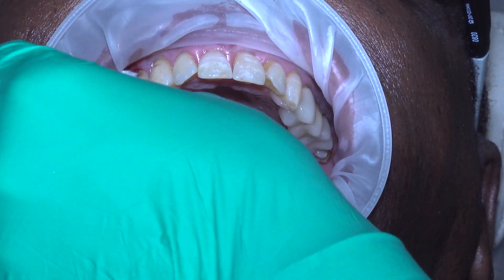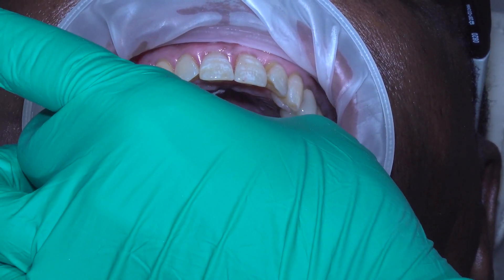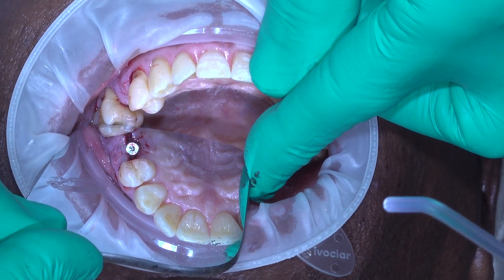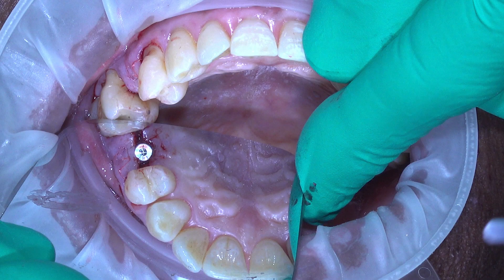Most of the time, if it's not loose, the tissue is self-sealing — it's going to hold its position and it's not going to go anywhere. Notice that little gap in the tissue — that's going to epithelialize with attached keratinized gingiva. We just apically displaced our buccal flap to help ensure we have three or four millimeters of attached gingiva on the facial. And despite doing the suture wrong and taking our time, we still did this whole procedure in under eight minutes, which is really fast for a patient. These guided surgeries at a healed site provide that kind of position control and efficiency. This has been another episode of Implants Made Simple. I'm Dr. Robert Stanley, a smile engineer, helping you re-engineer your practice every day.